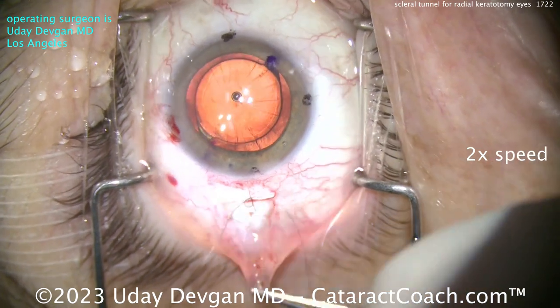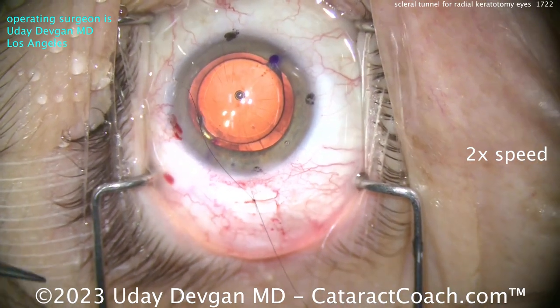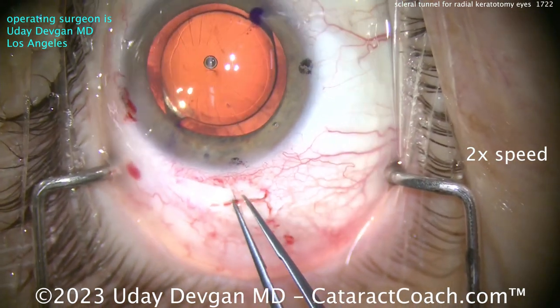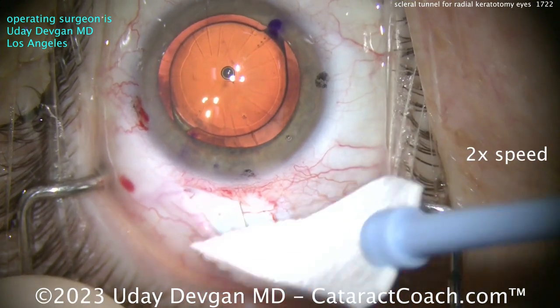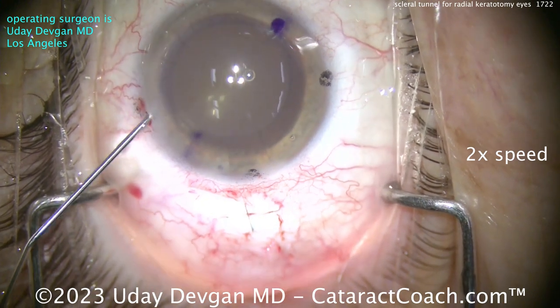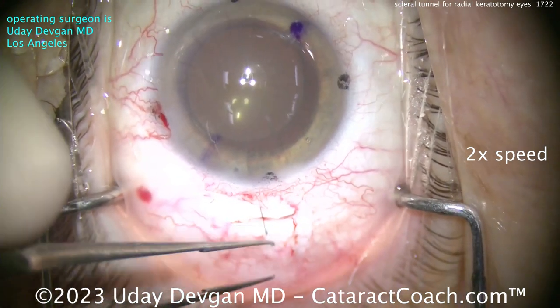Then we close the conjunctiva. This patient's surgery was done a month or two ago and the patient did great — one of those out-of-town patients who flew into Los Angeles for the surgery. Today I had four patients with prior RK, and all four of them needed scleral tunnels for 16, 18, and 24 cut RK — and another with 18 cuts. I'm used to doing these scleral tunnels. You really want to get this technique down — very useful to have.